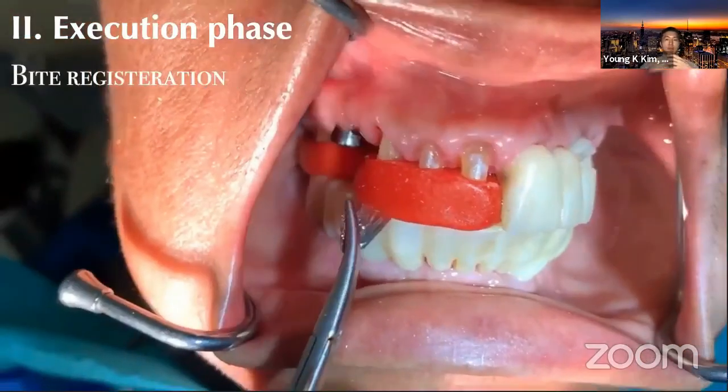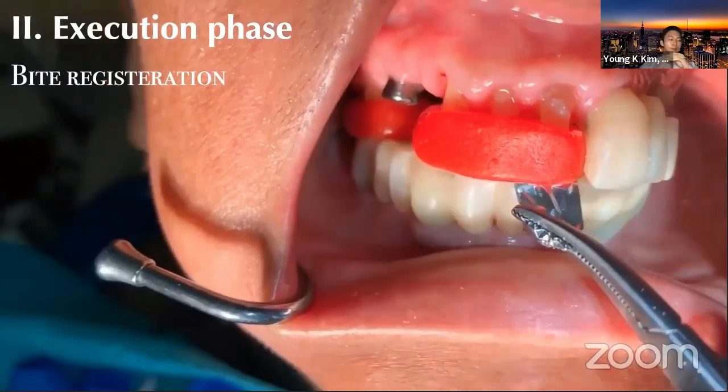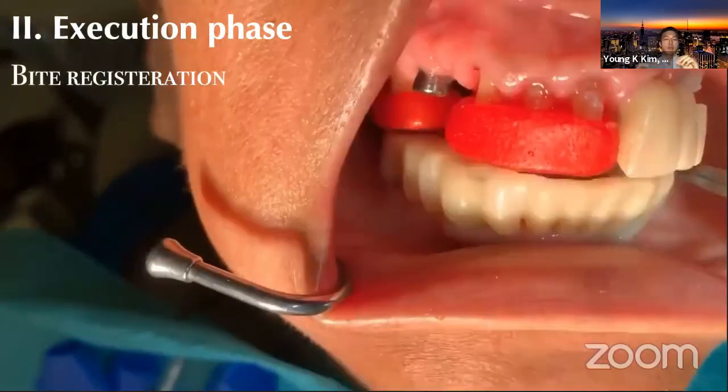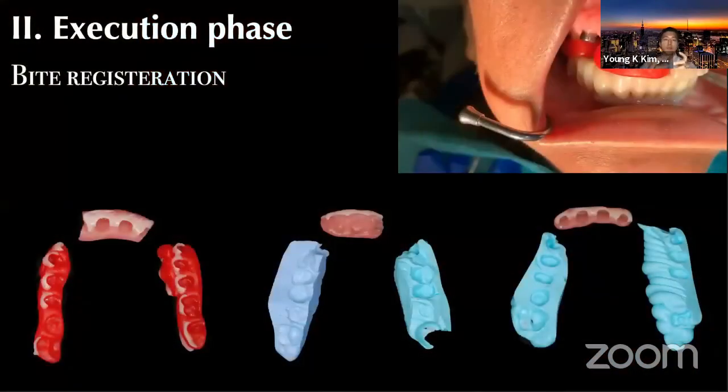And you take the bite registration. It's absolutely critical to take the bite registration, and later I will elaborate on the cross mounting technique. But I personally prefer to use GC Pattern Resin with a micro thickness of shim stock and have the patient bite down. And segmentally, I take the bite and verify, and remember the verification process. I do the verification at each step, every single segment of my bite. And then when you take the cross mounting, the basic analogy is you take the bite of the maxillary provisional versus the mandibular provisional, and then the maxillary provisional with a mandibular prep, and then the mandibular provisional with a maxillary prep, and then ultimately the prep versus prep.